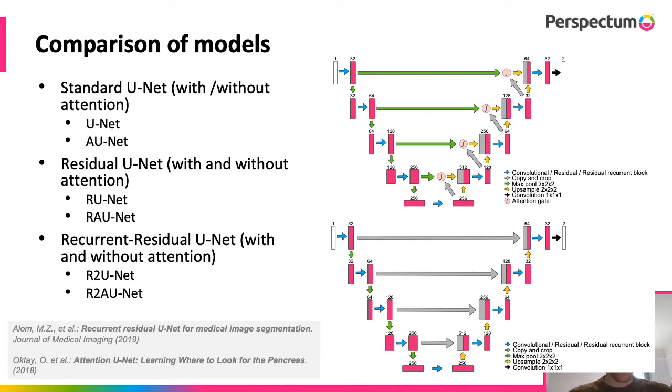In terms of the segmentation model that we chose to use, we wanted to run this pipeline to segment 42,000 pancreas, hence the need for automation in this case, and it also increases reliability and decreases subjectivity of the segmentations.